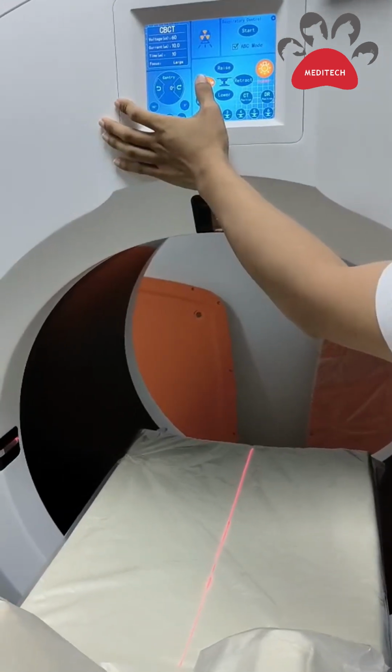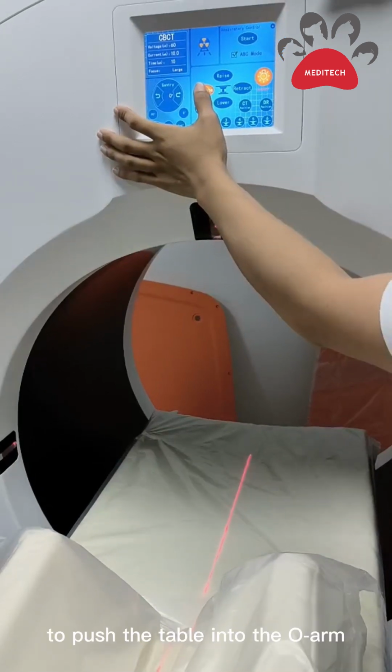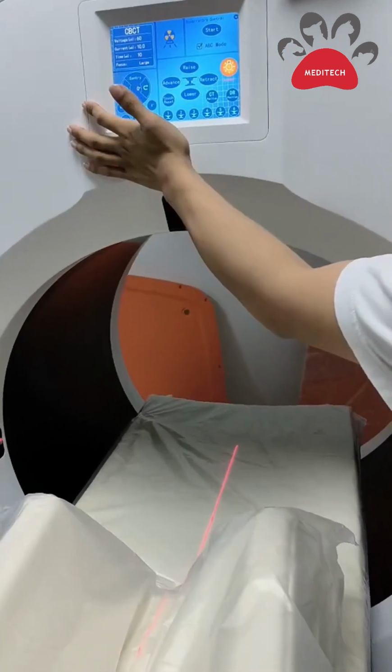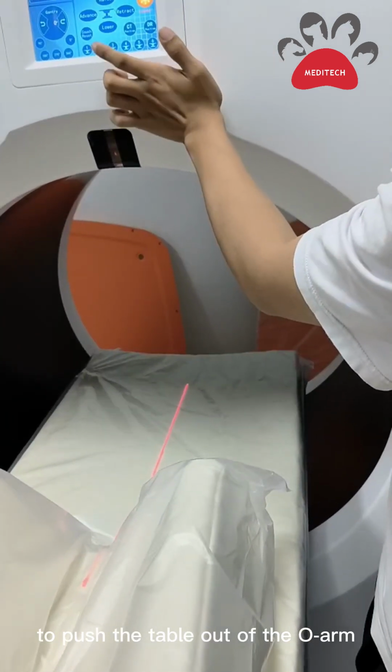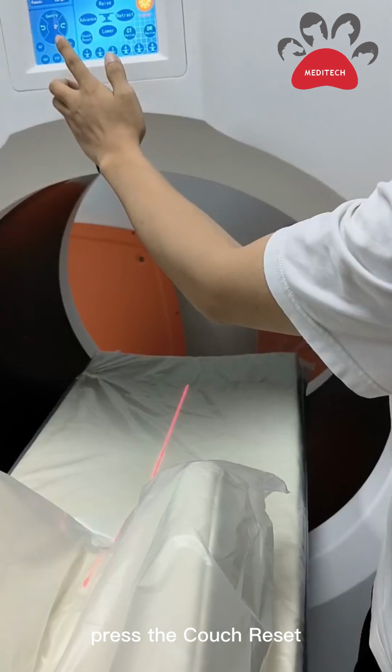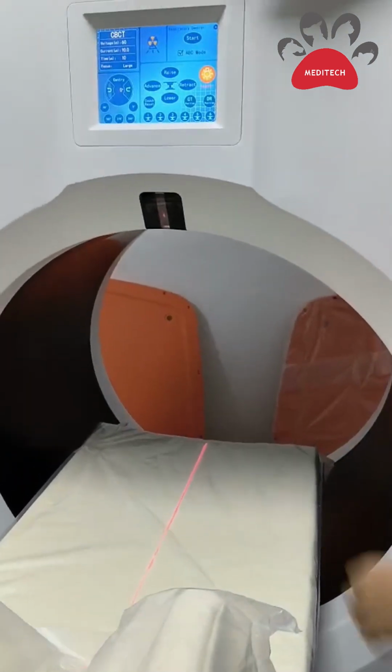Press advance to push the table into the arm. Long press retract to push the table out of the arm. Press the couch reset to reset the table back.